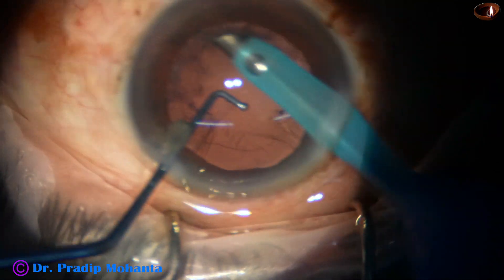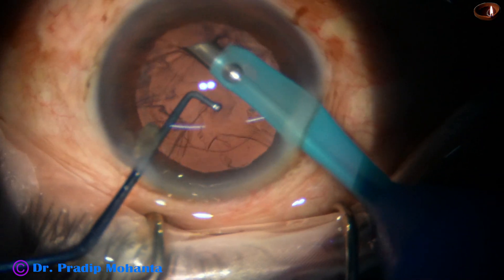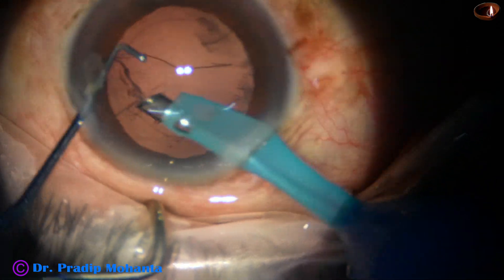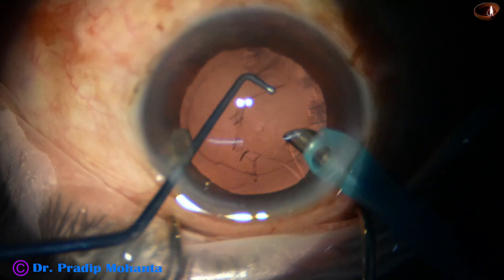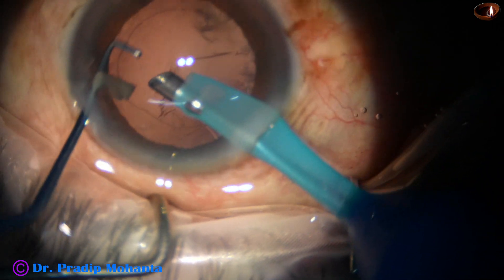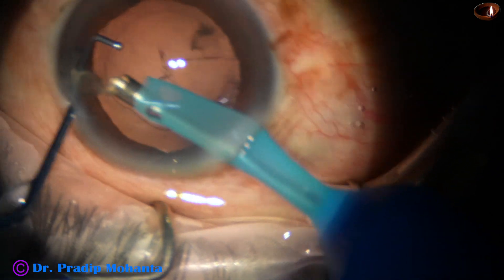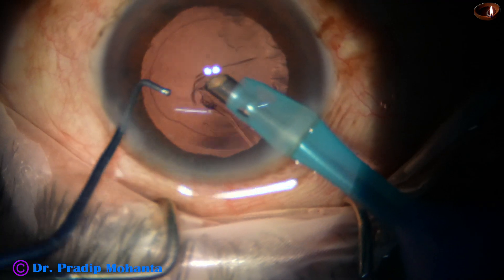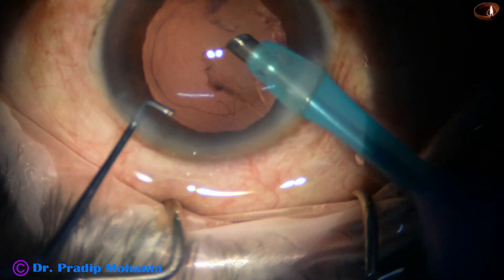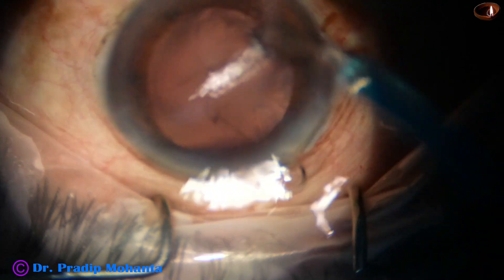Observe this. At this point, suddenly, I have caught the posterior capsule. I released it and started removing some more cortex by the handpiece itself. This is a small epinuclear piece — nuclear or epinuclear — which is emulsified and removed.